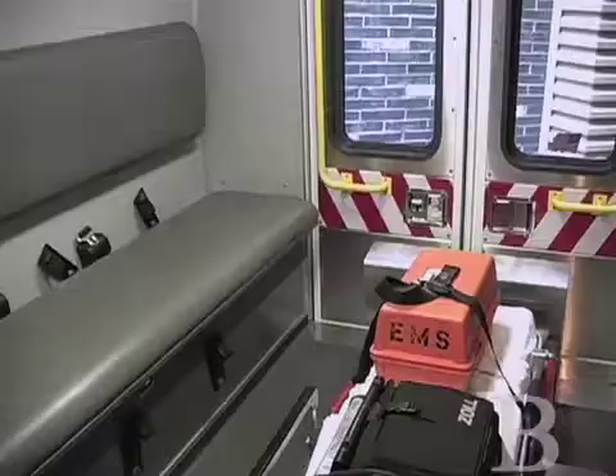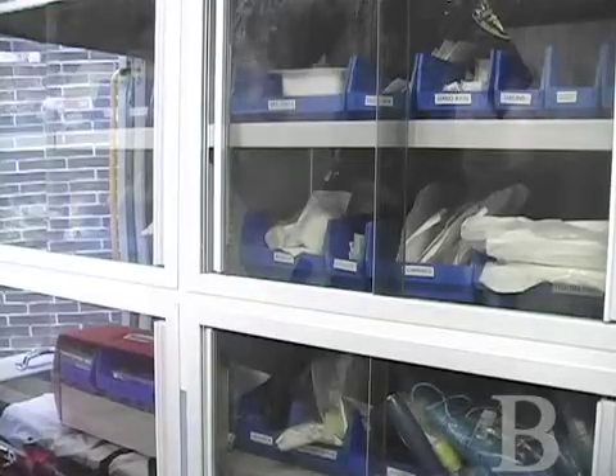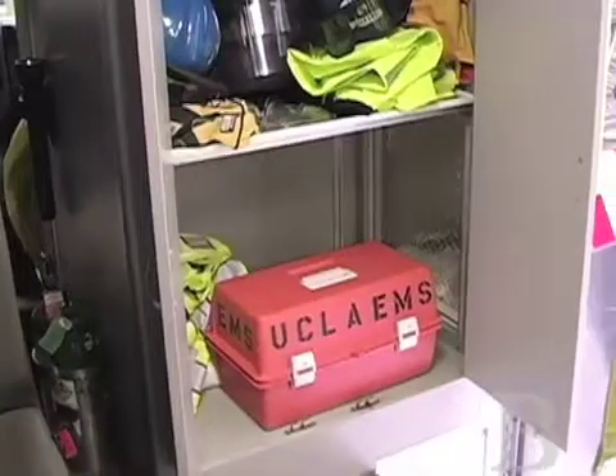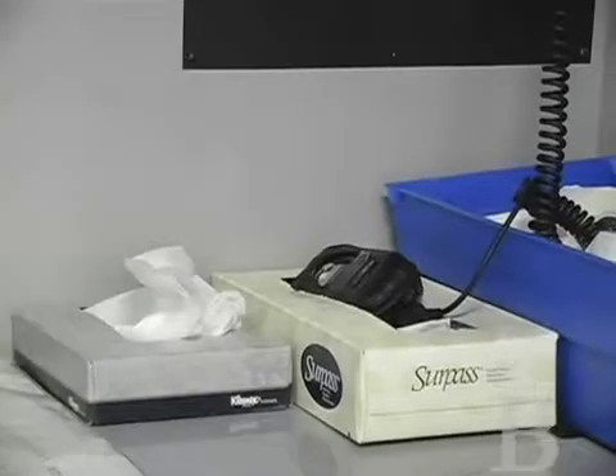Here in the rest of the ambulance, it's pretty much the same equipment that you see on the gurney. We just use this to restock the gurney, so we can run five, six, even more calls back to back without having to come back to the station.